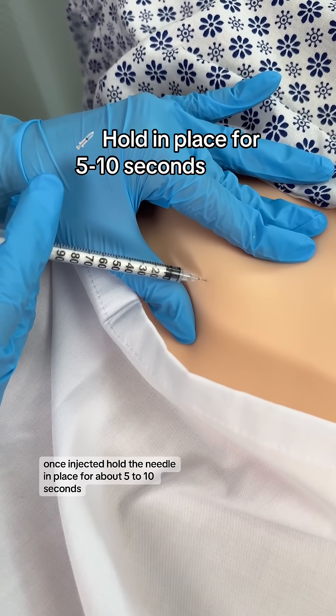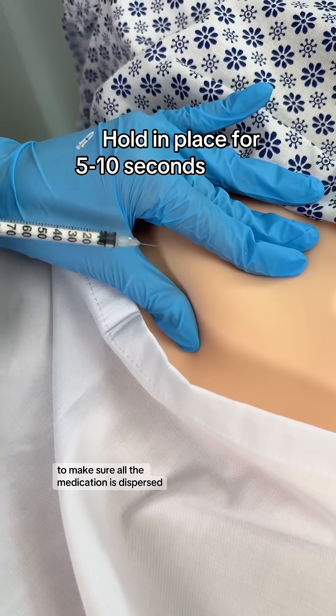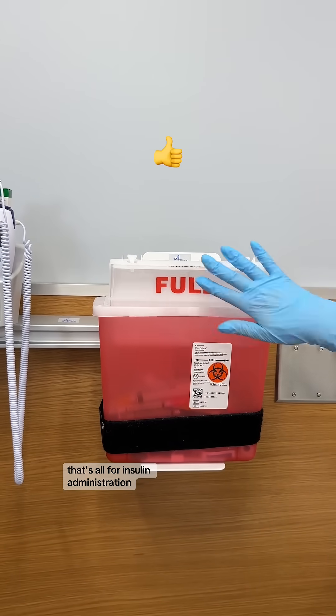Once injected, hold the needle in place for about five to ten seconds to make sure all the medication is dispersed. Engage the safety and dispose it in the sharps container. That's all for insulin administration.